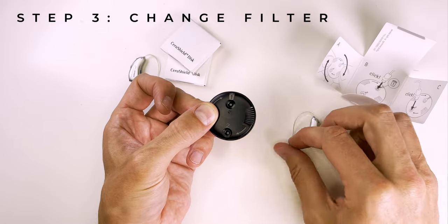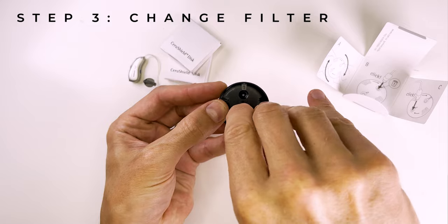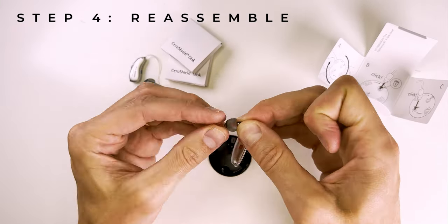Once it's done, repeat exactly the same action in window number two to pick up the replacement wax filter. And again, you'll notice it goes from having a filter in the case to being completely empty. Once this is done, pick up your rubber dome and reattach it to the end of your hearing aid.